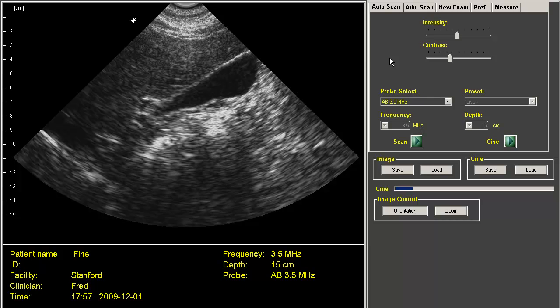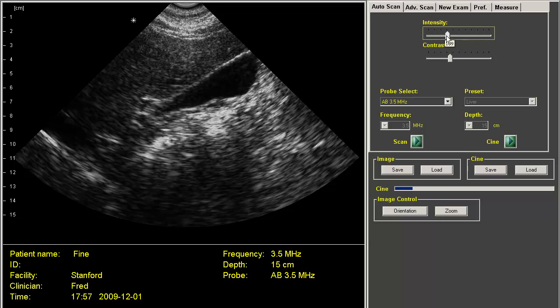When you first launch Seymour, the first thing you'll see is the auto scan, which is the default. It's very simple. You can adjust the intensity or the contrast according to your taste. You can change frequency and depth from here, but we suggest you select a preset. This happens to be the liver preset, because if you choose this automatic setting, you'll get a good image every time.